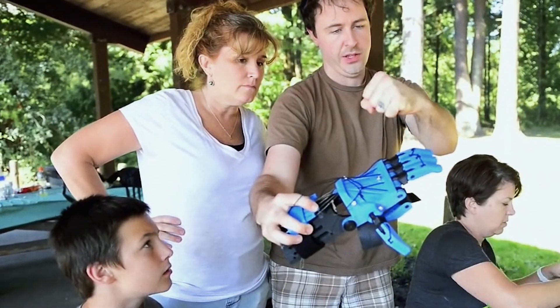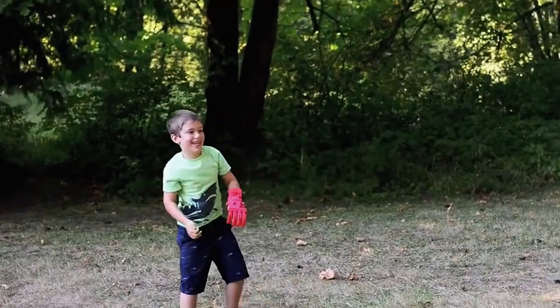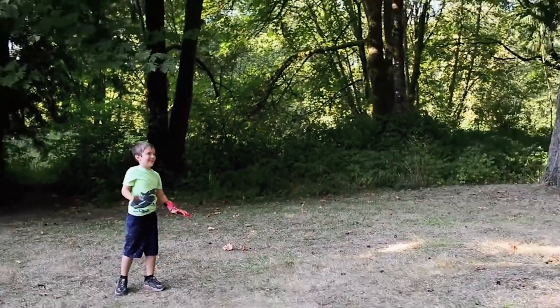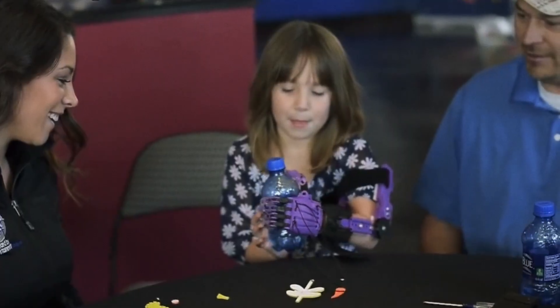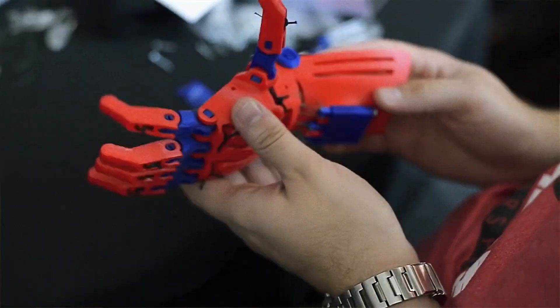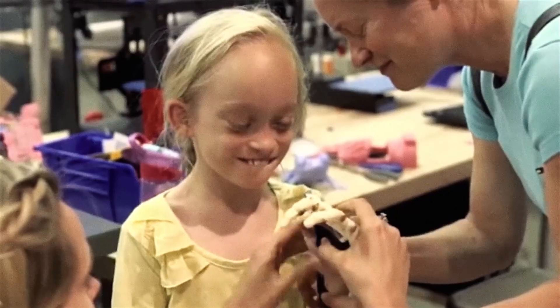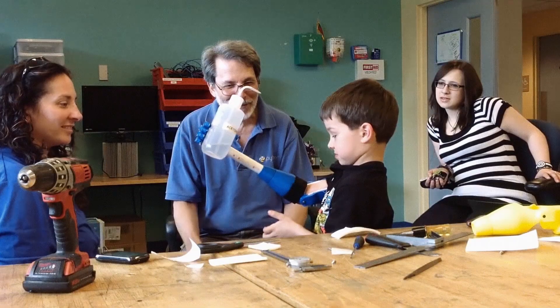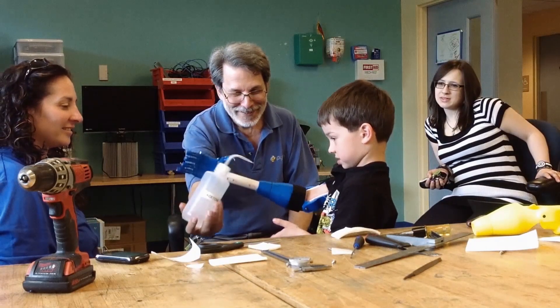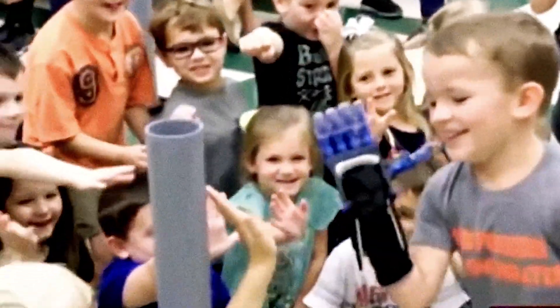One of the reasons 3D printing is so well suited to this problem is no two cases are exactly the same. Some kids are missing all of their fingers; some are missing even the palm and the wrist. One of the reasons we can produce these devices for incredibly low cost — well under $100 — is these devices are entirely body-driven, purely mechanical, so there are no motors, no sensors, no heavy batteries. It's a very lightweight, very simple device. These hands don't even pretend to look like normal hands — they look like something Iron Man or a superhero would have, and the kids love them for that reason.